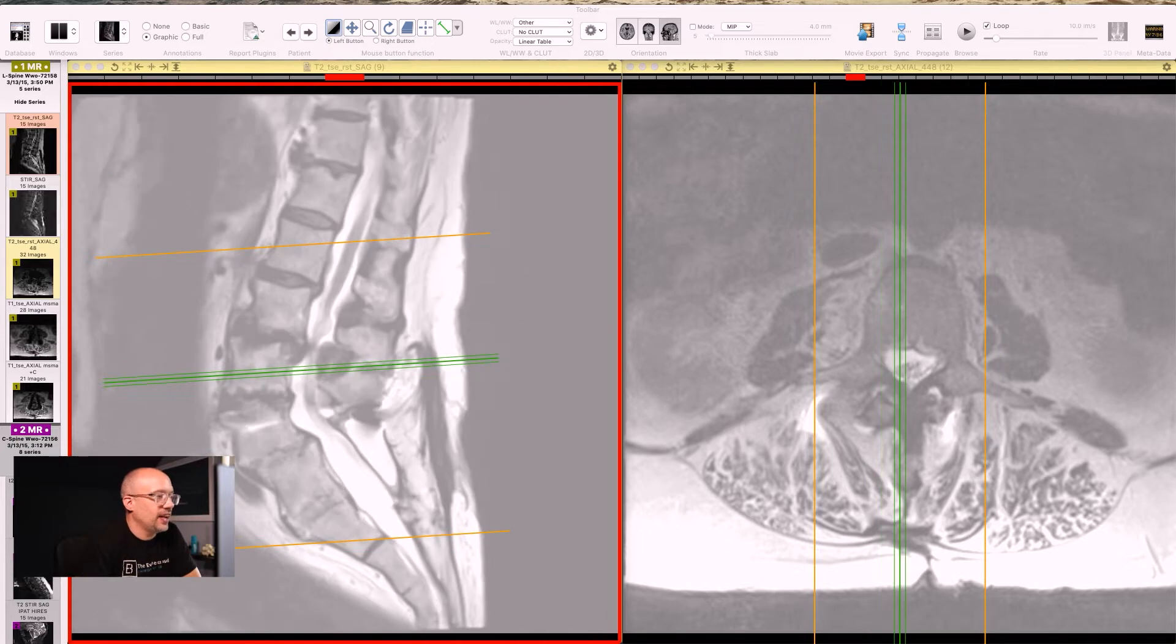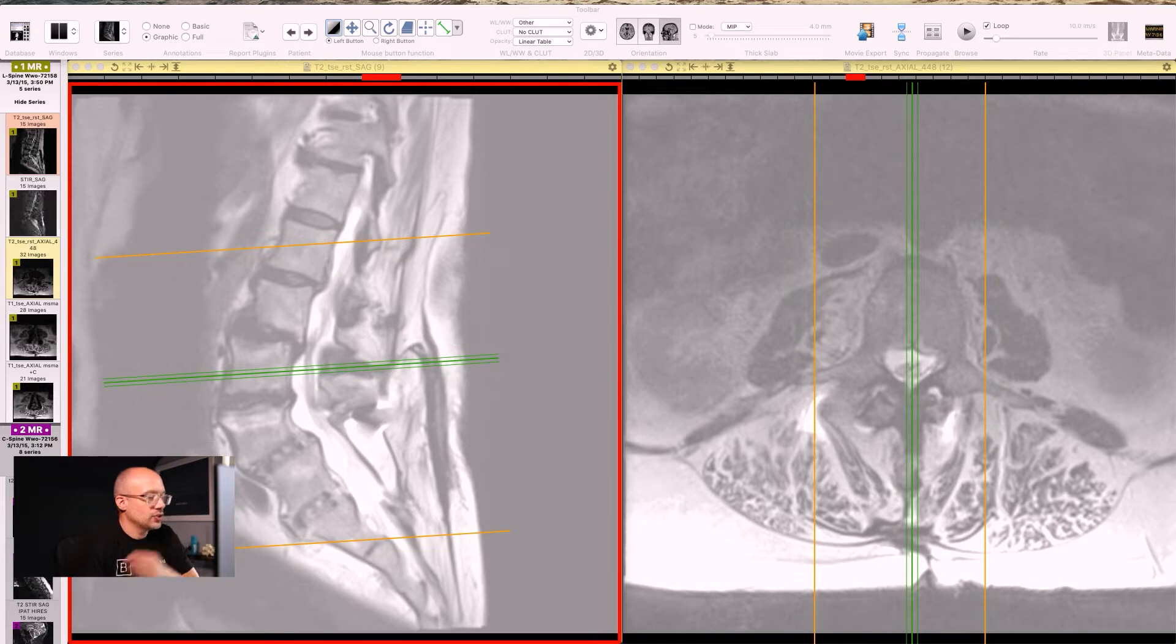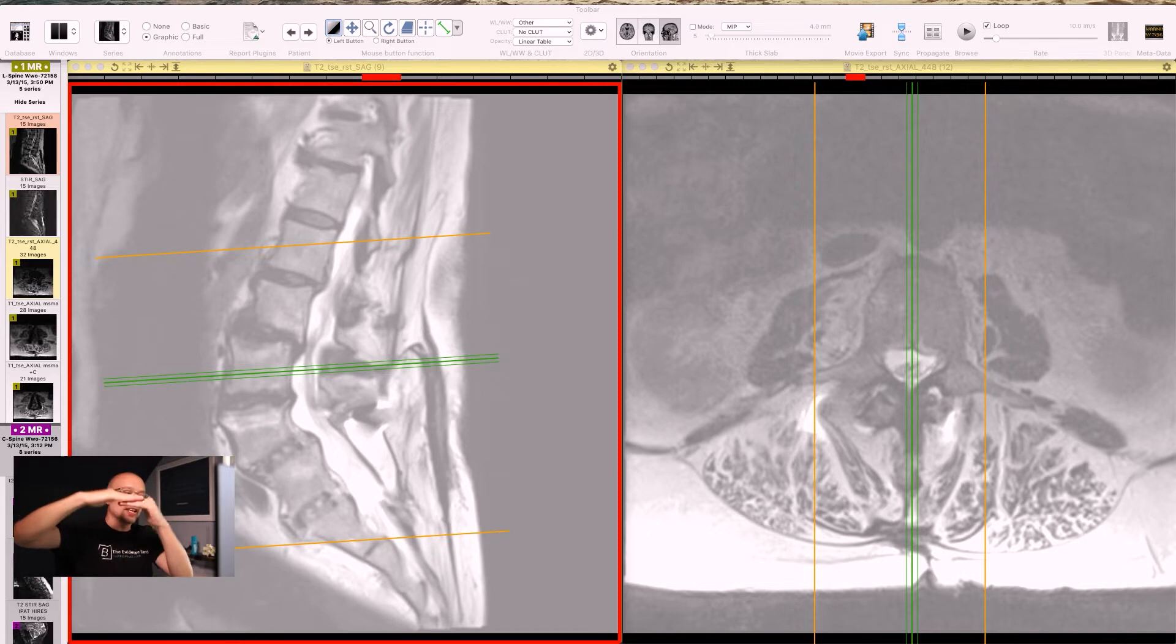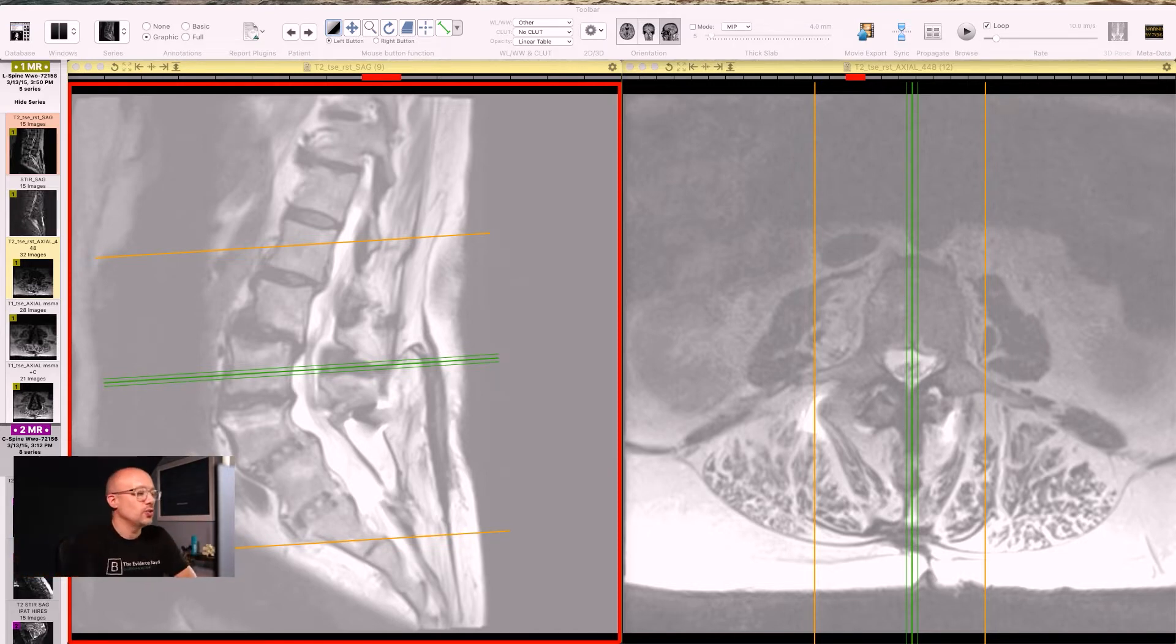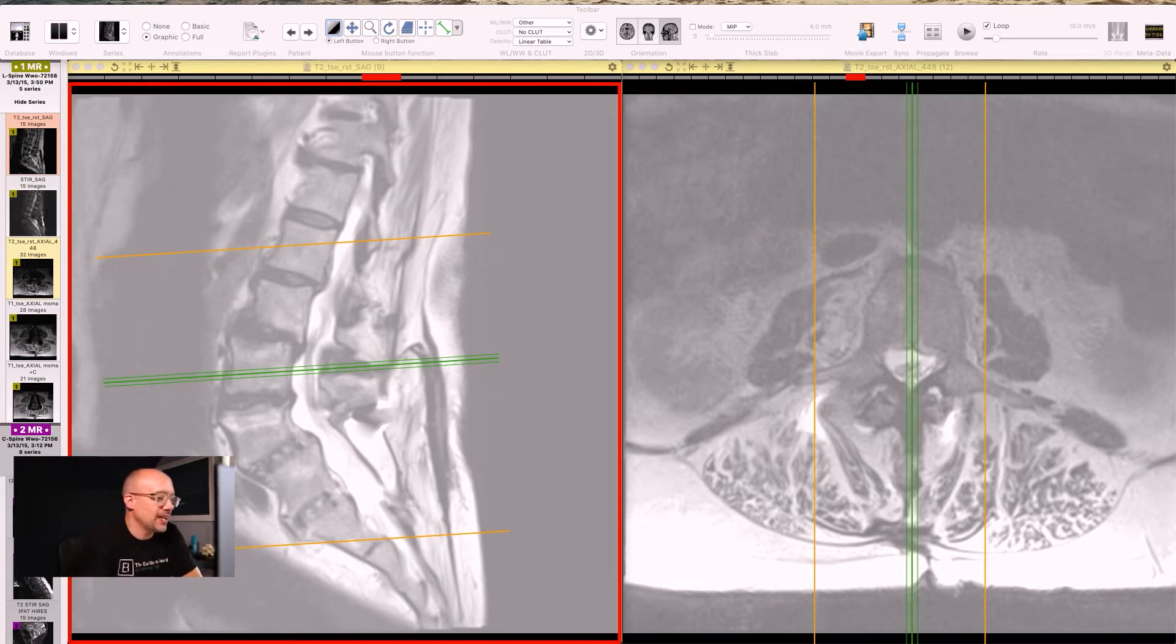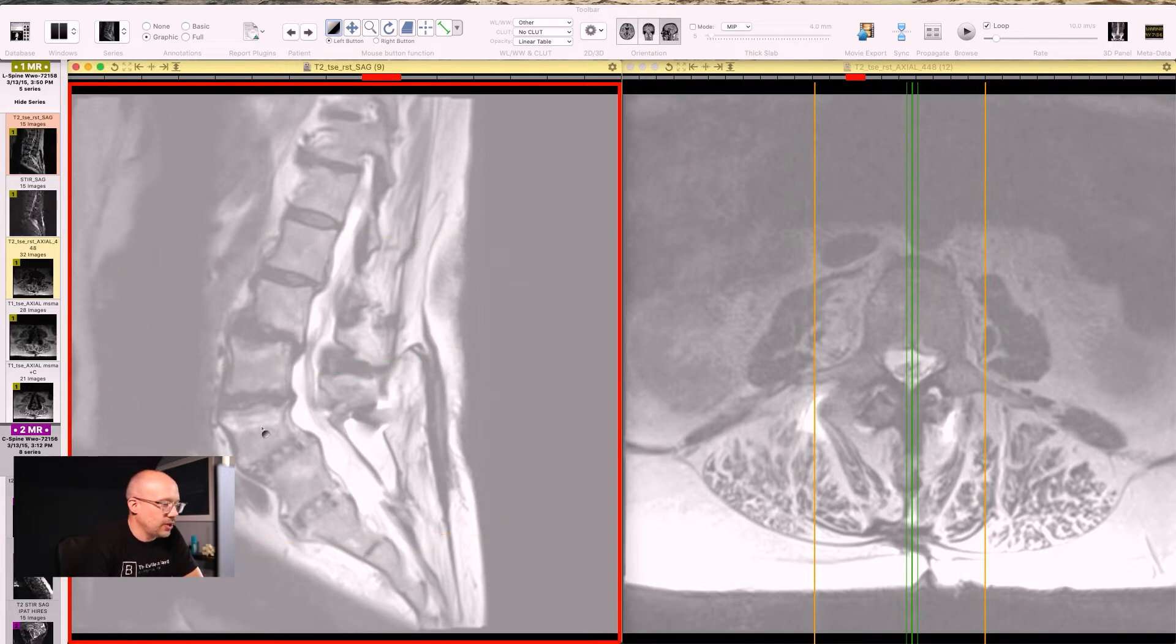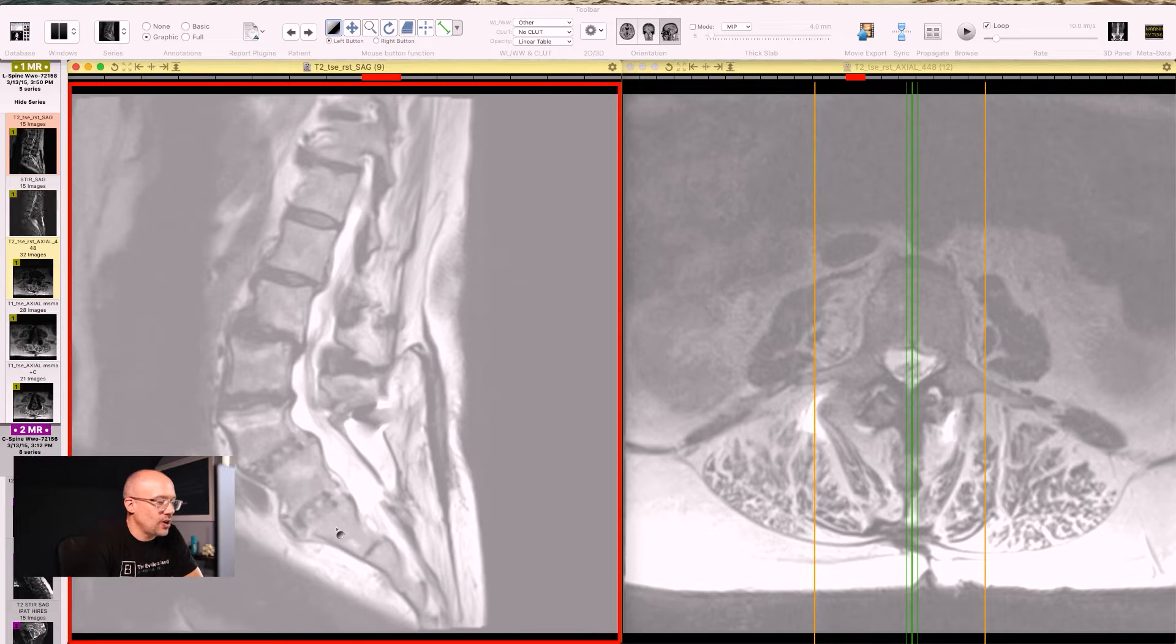I'm going to start on the left-hand side of the screen. The yellow lines on your screen are showing you exactly how far up and how far down the scan goes. And the green line is what we refer to as the scout line. It showcases to you where you are in space. So the big gray squares here are the bones. Your big gray squares are the bones. Those are the vertebral bodies. This is L5 all the way down here. This is L5. That's S1.